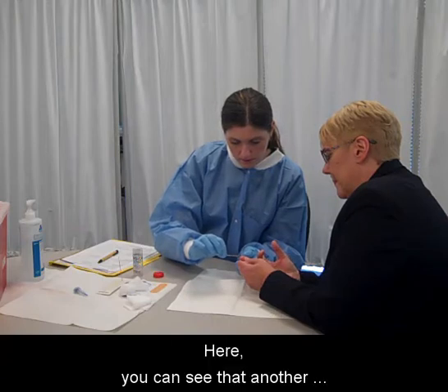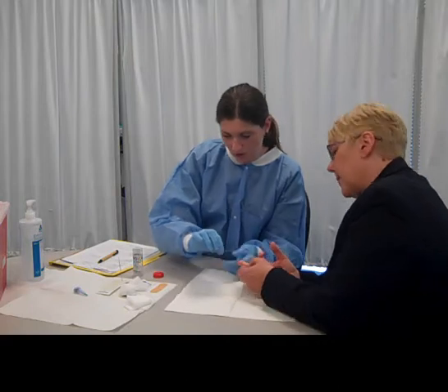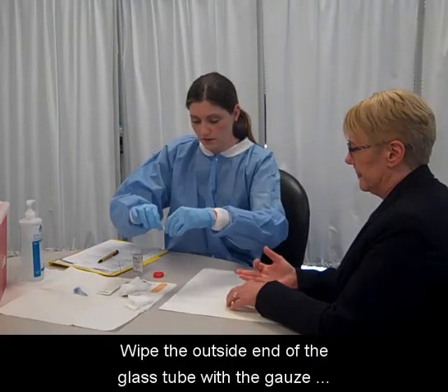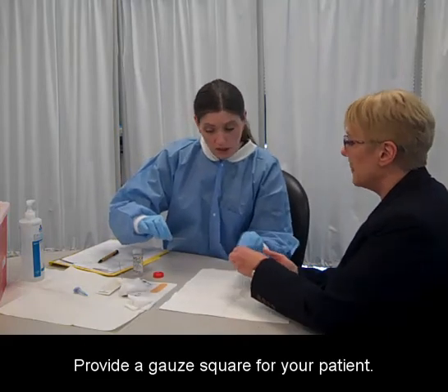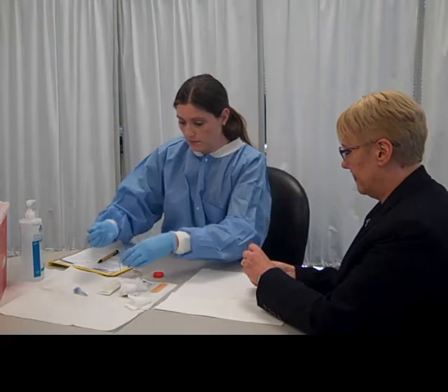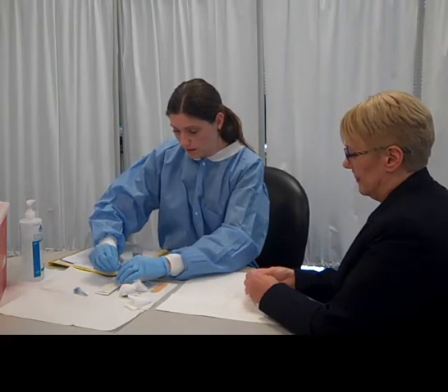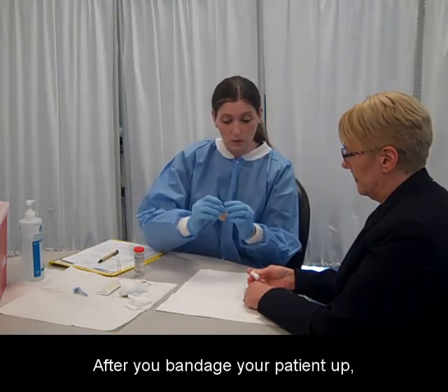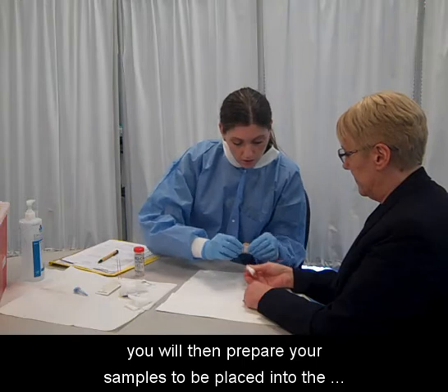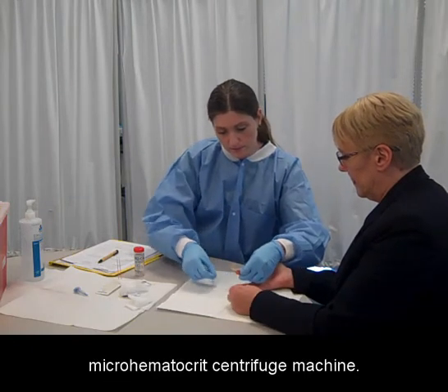Here you can see that another sample is being taken from the patient. Wipe the outside end of the glass tube with a gauze square before you seal the tube. Provide a gauze square for your patient. After you bandage your patient up, you will then prepare your samples to be placed into the micro hematocrit centrifuge machine.